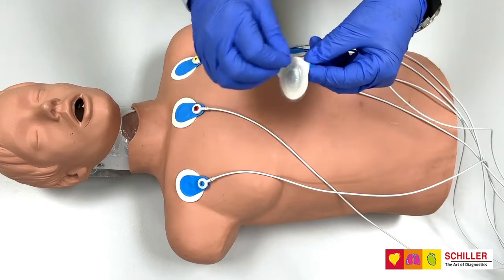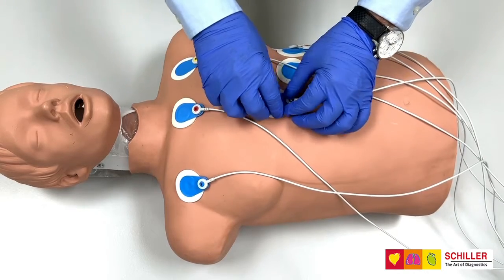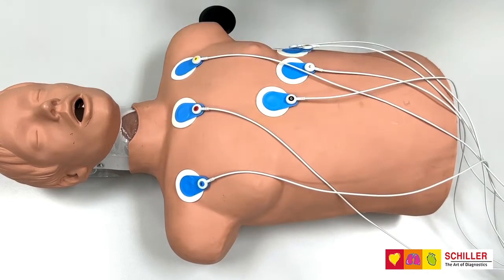Once you have this done, just peel the electrode and place it on the correct position as per the user manual.